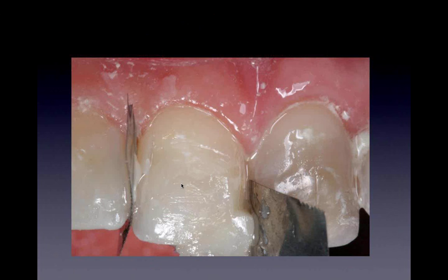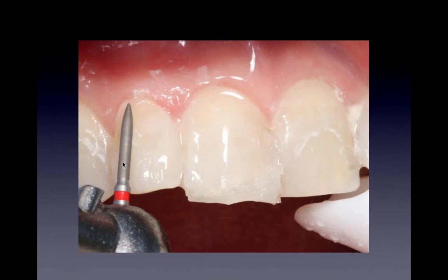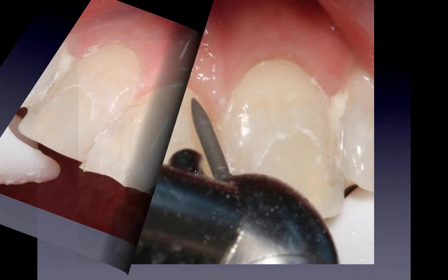We get it to this point. And now I start using my red, and I start polishing in here. And you can see that little delineation here. So if I start seeing the colors too translucent, I re-prepare it, re-etch it, and then add a little color. If I don't get the color that I want, and I see it has too much trans in there, I'll start changing it. Whenever you see things that are too trans, you just take them off and start over in that little area if you need to.